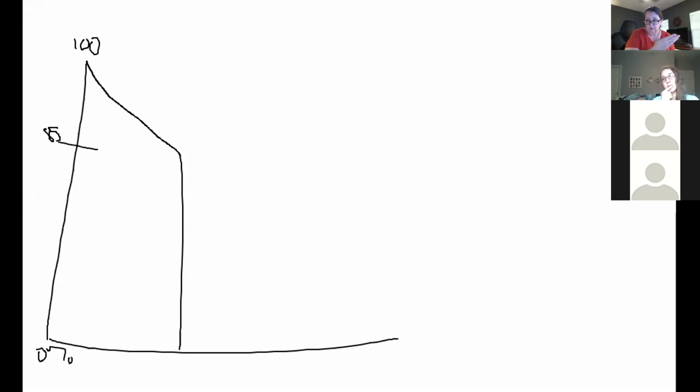These are going to be your gold standards that I want you to know for the test. If you cannot use the tongue, or you've got a black tongue, black pigmented lips. But what's going to happen is the light shines through. You still see the graph? Do you guys still see the graph?